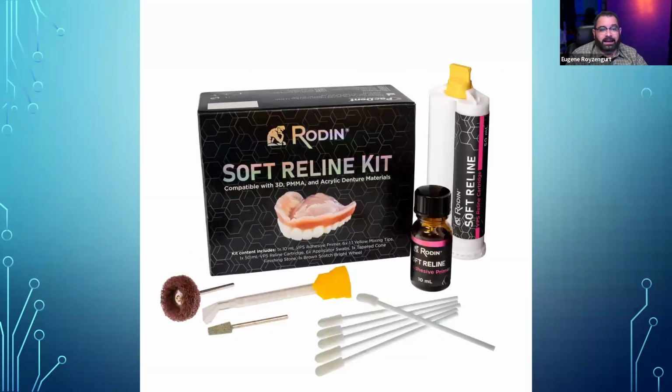Okay. The newest thing that I started doing is using this soft reline material. Now, if you guys do a lot of 3D printing, especially for removable, you will know that soft liner material just does not stick to denture bases, whether try-in resin or denture base resin. There's, I think, 1 or 2 out there that it actually does stick to. Not all of them, but some of them. I think Dentsply is one of them, but the majority of them don't. And if you guys want to spend, I'd say, $1 million on Dentsply resin, then it's up to you. For me personally, I don't want to do that.